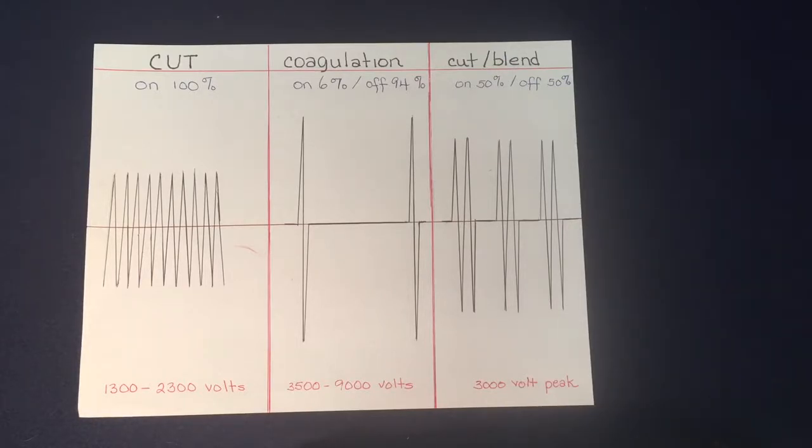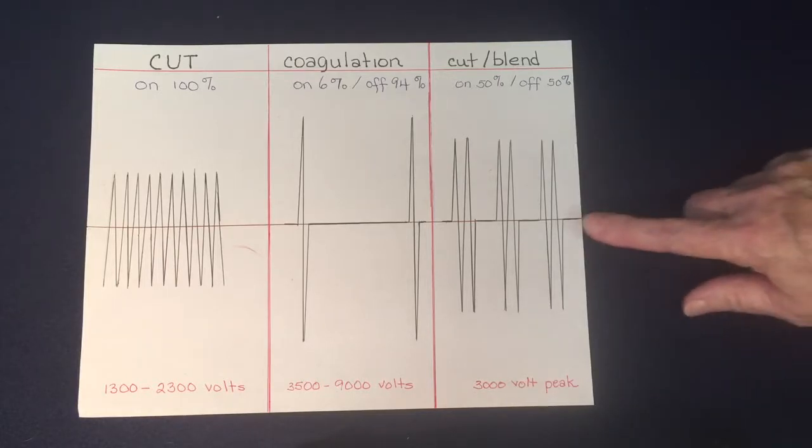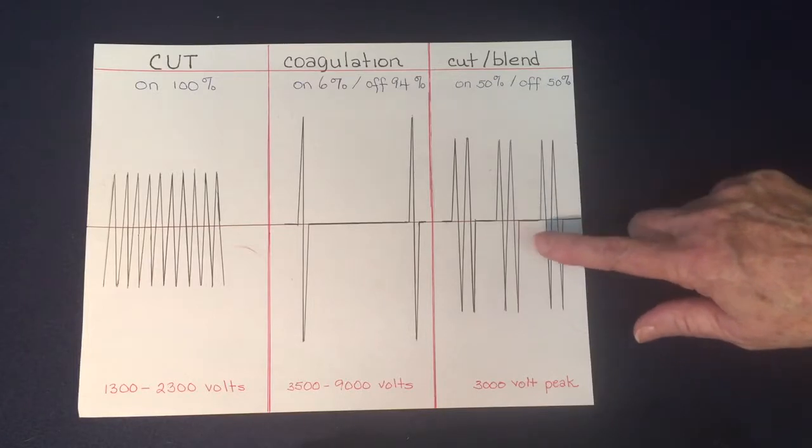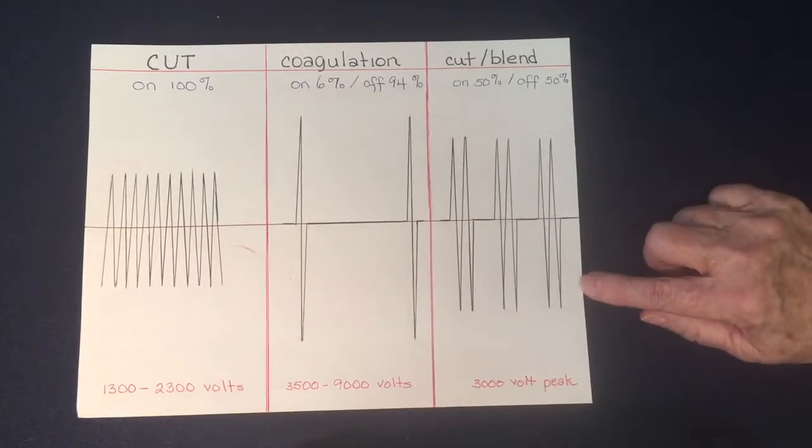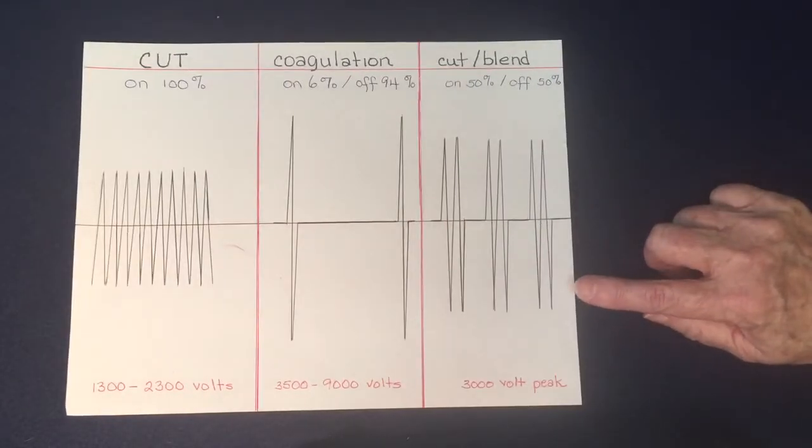The voltage is somewhere in between the cut and the coagulation at a peak voltage of 3000. As you can see, that's going to do a little more adjacent burning but it's also going to stop the bleeding, so if the surgeon is using cut, he's probably going to want you to use a blend.